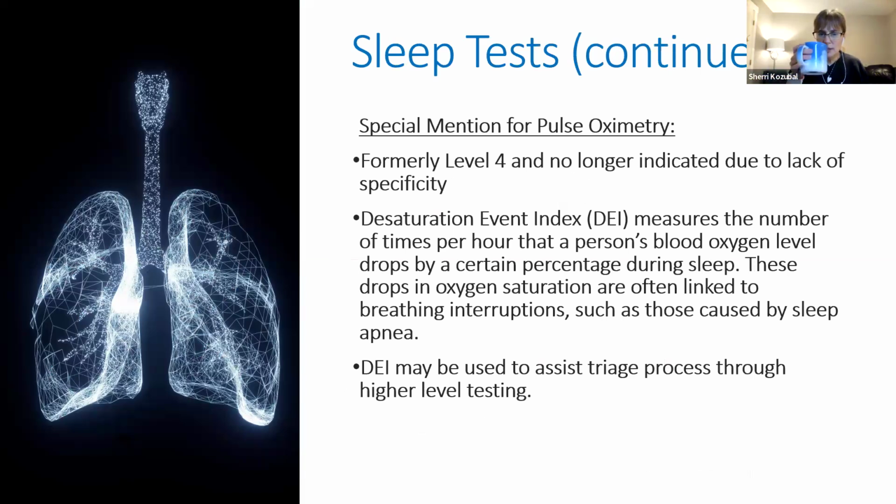This is another one I wanted to bring special mention to: pulse oximetry. We used to call it a level 4. We no longer do it here in Canada because of its lack of specificity. We're using it only to determine baseline oxygen levels at night.